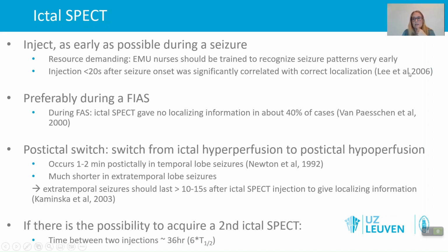In a study from Lee et al. in 2006, they concluded that if you inject earlier than 20 seconds after seizure onset, this was significantly correlated with correct localization. But 20 seconds, it's already rather fast.